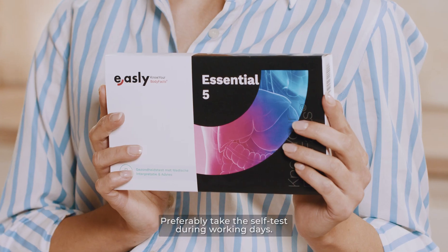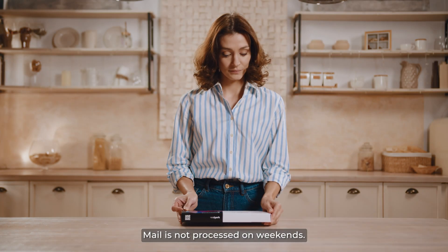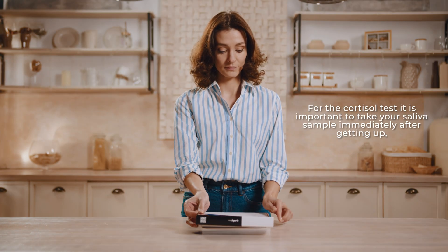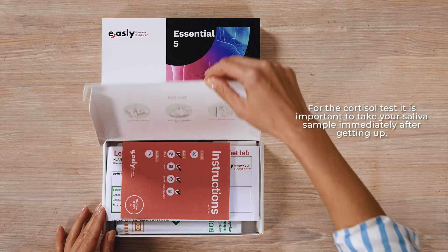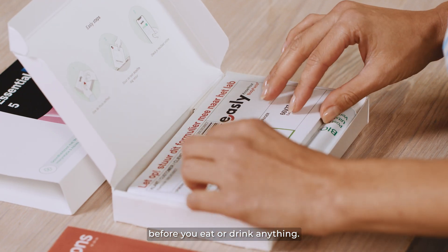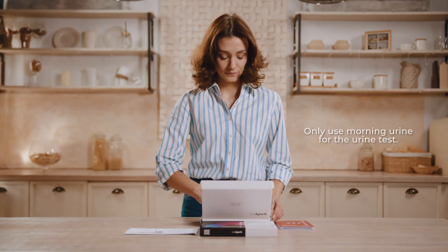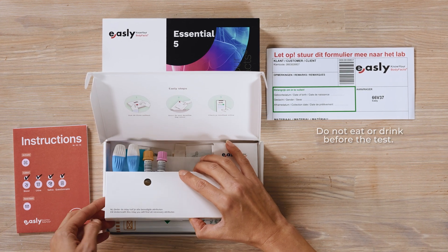Preferably take the self-test during working days, as mail is not processed on weekends. For the cortisol test, it is important to take your saliva sample immediately after getting up, before you eat or drink anything. Only use morning urine for the urine test. Do not eat or drink before the test.